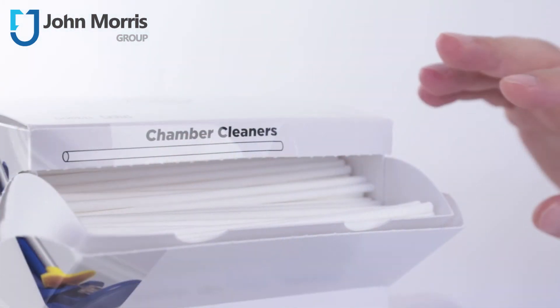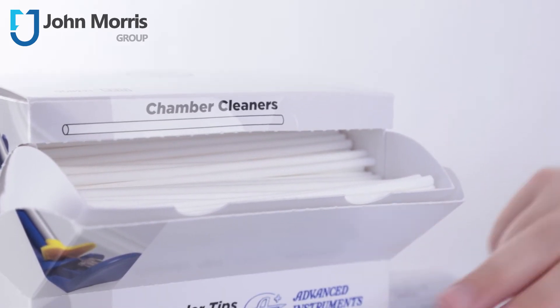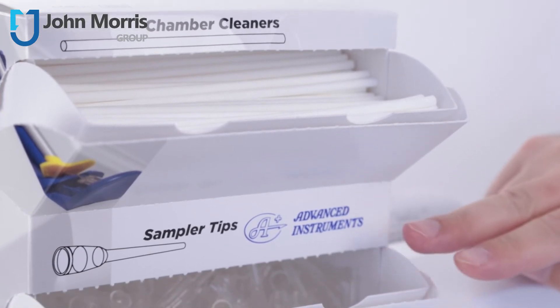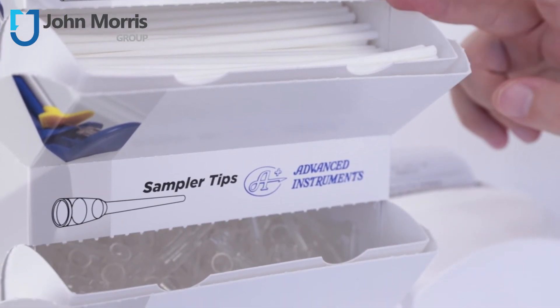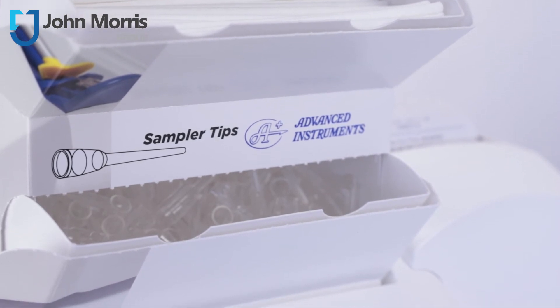It's really important to take good care of your osmometer. One way to know if things aren't going quite to plan is whether you end up with more chamber cleaners or more sample tips. If these two boxes seem out of alignment, it's probably fair to say you aren't cleaning the chamber between each run.